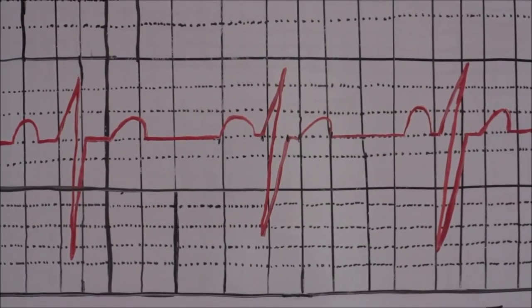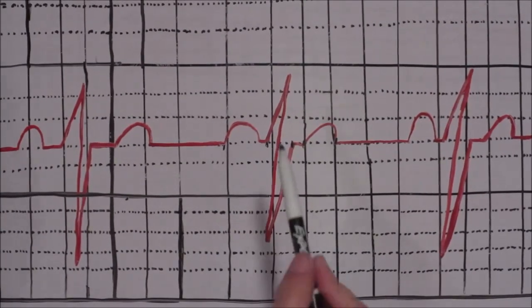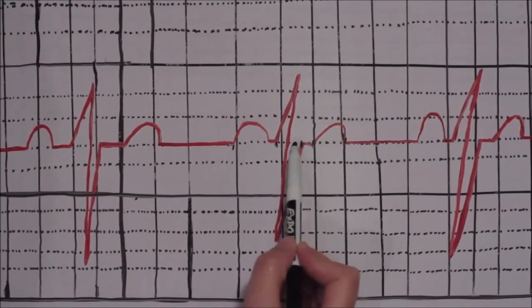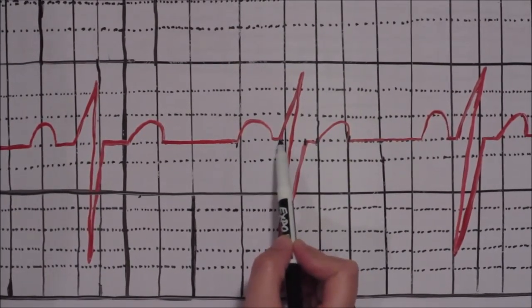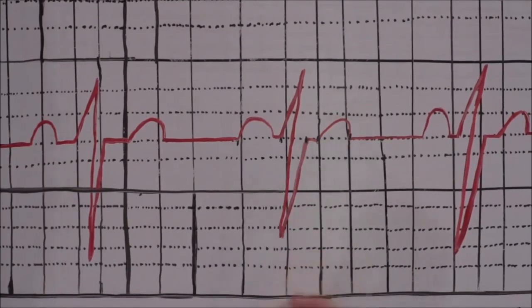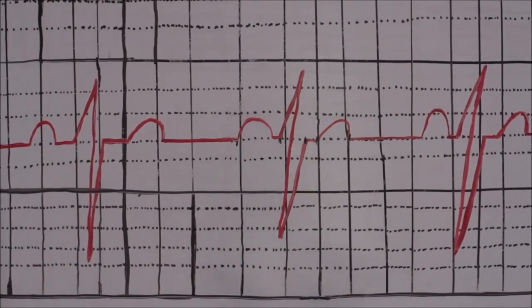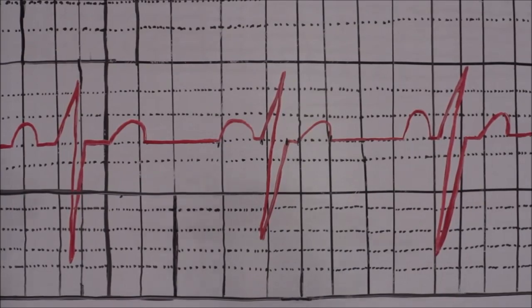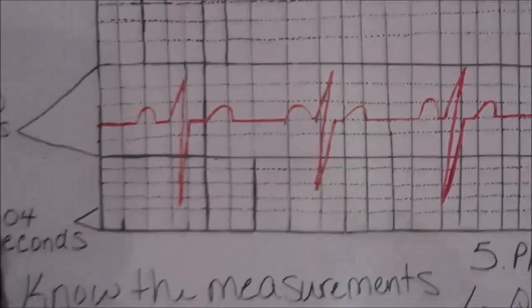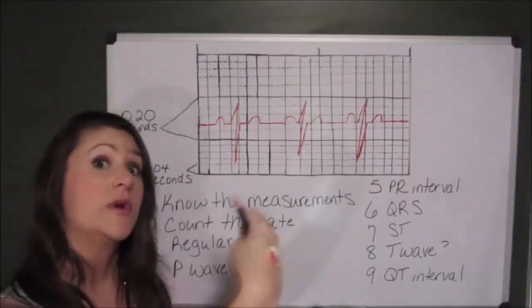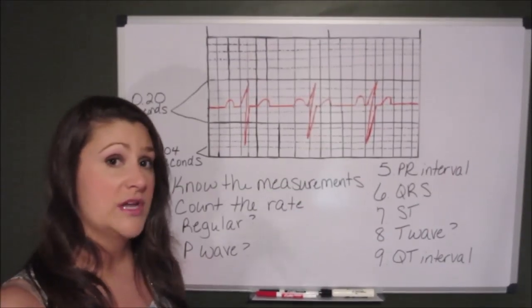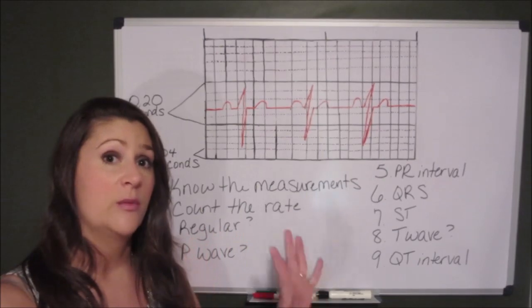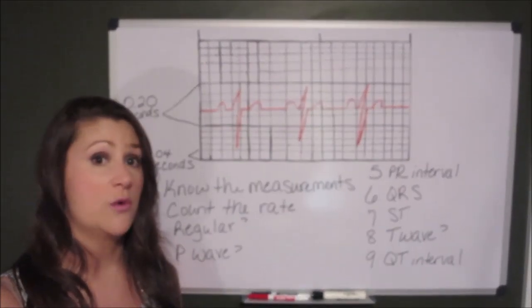QRS interval. Start here where the Q starts to leave the baseline. Stop counting here where the S wave returns to the baseline. This one would be about 1 small box length, 1 small box is 0.04 seconds. That's well within our parameters. Any QRS interval that is longer than 0.12 seconds, which would be 3 small boxes, would indicate that there is a bundle branch block. Meaning that there is a problem with conduction through the bundle branches. A problem with electrical conduction. That doesn't mean that there is a physical blockage.